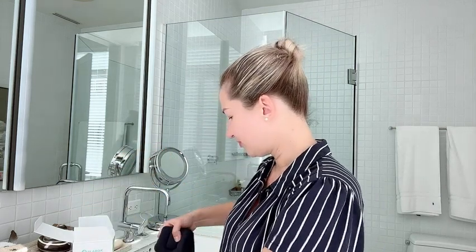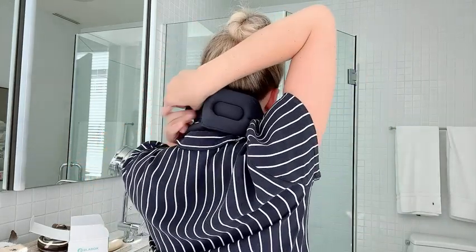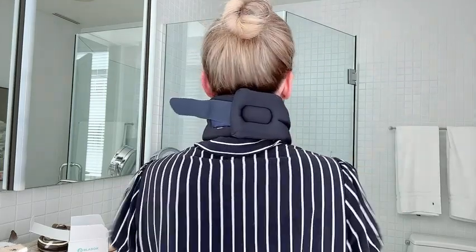Here is your warm adjustable strap — it is velcro — and I absolutely love it. Let's see how it feels. I'm just strapping it on the back like this, and it kind of limits your flexibility.